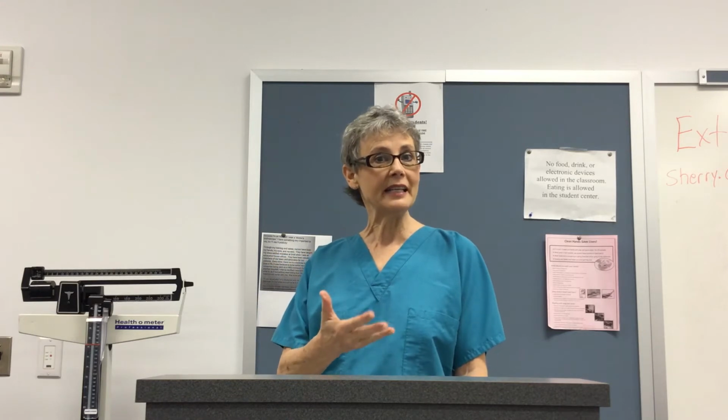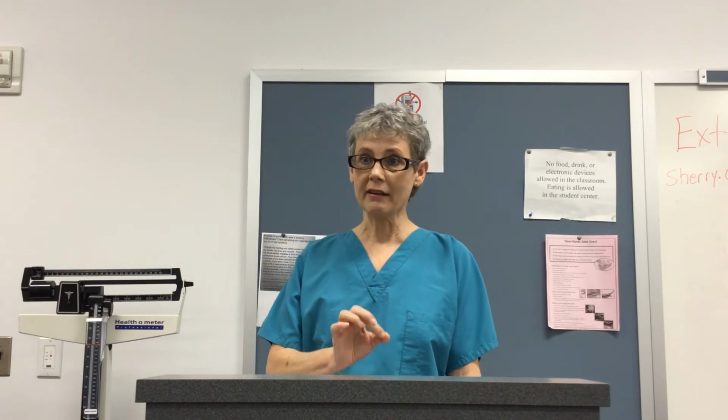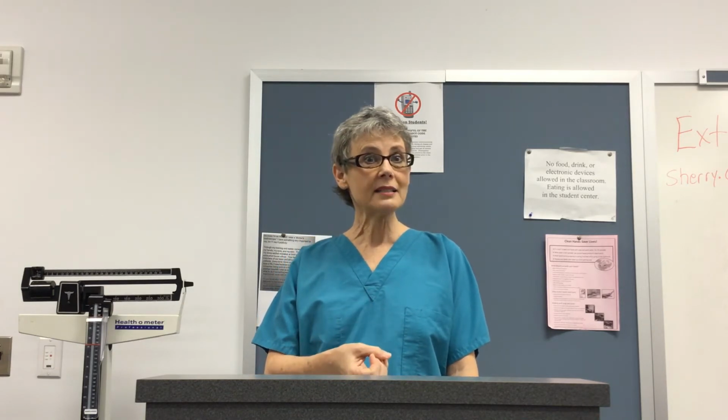Reliable access to an IV is a very basic necessity of medical care. As I said earlier, with all those different conditions, a patient will definitely need some IV fluids, or even having the saline lock in just in case something goes wrong. We hope not, but it's always good to have that vein already accessed in case of an emergency and we need to get fluids into the patient quickly.